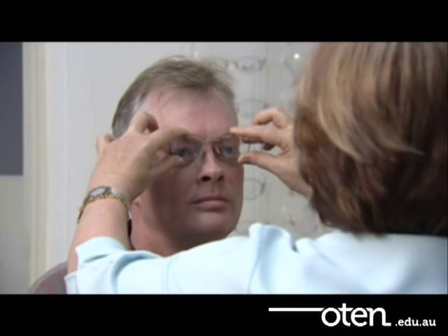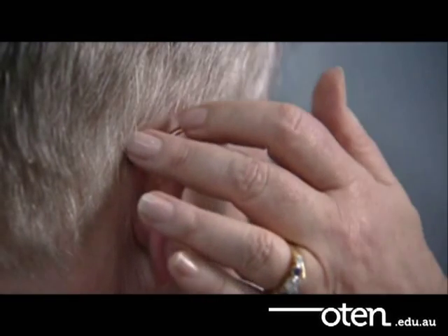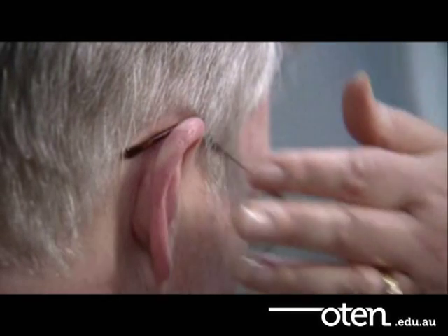It's very important to ensure that the frame is in its final fitting position before you take any measurements. Just have a look at yourself in the mirror and see what you think. Yeah, they look quite nice. Yes, I think they're good.